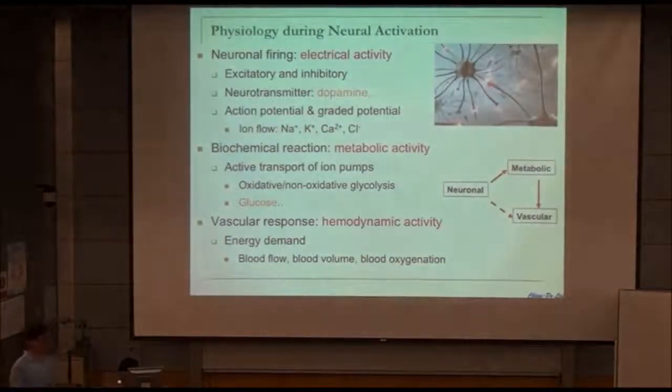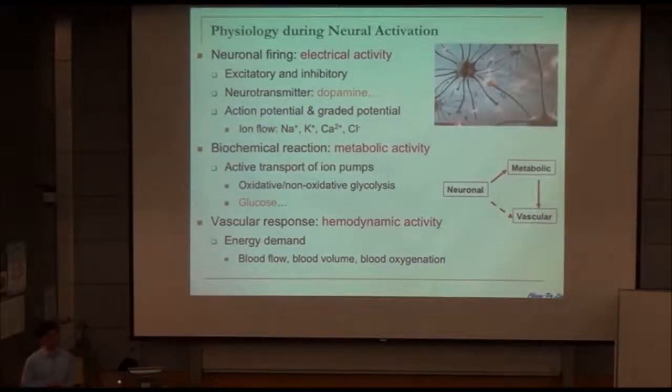Further, let's talk about function. How can we measure brain function? As Professor Peng just introduced, we want to know the input or output, the signal, and how the brain processes that. The most important idea is that we want to have non-invasive detection. So how can we have a non-invasive detection?